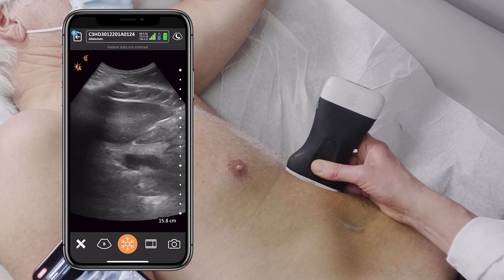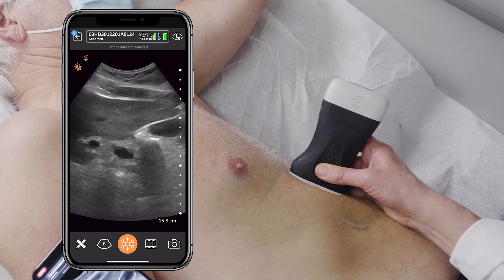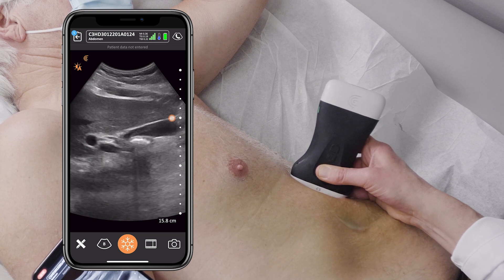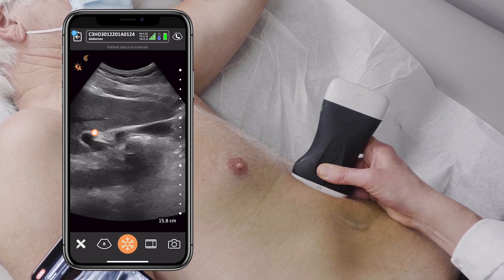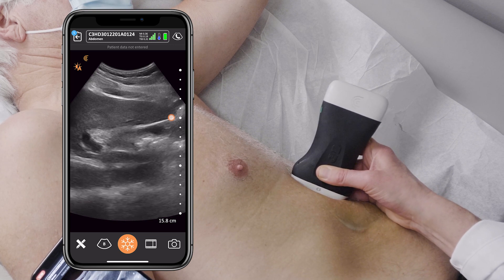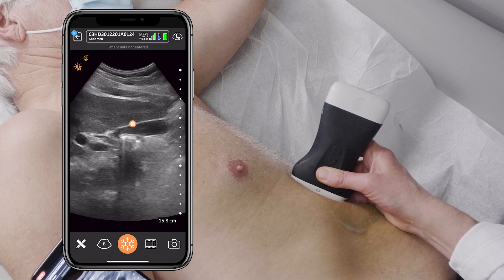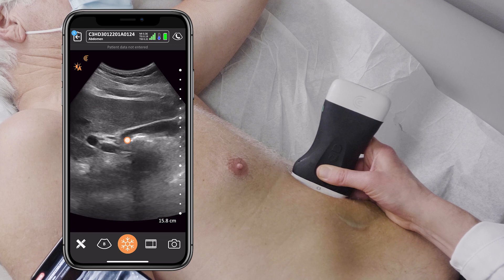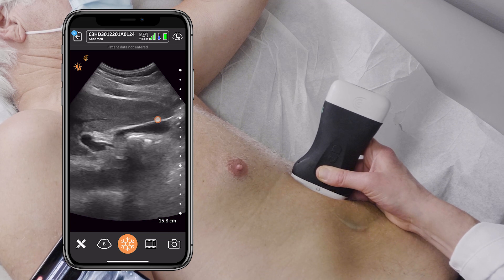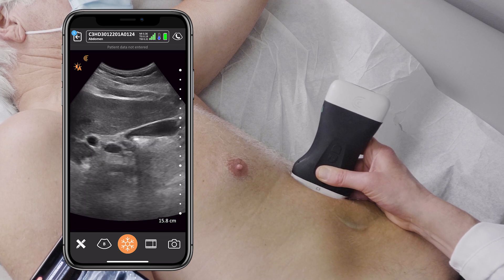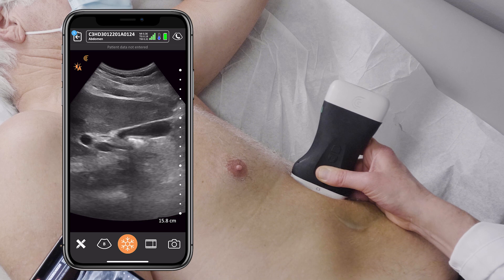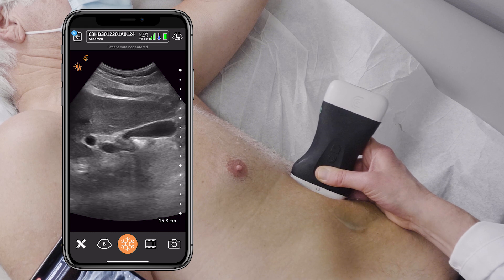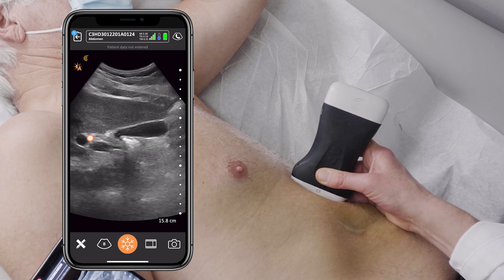I'm just going to follow the margin of the liver and you'll see that the gallbladder pops into view, looking like an exclamation mark — with the gallbladder being the upper part of the exclamation mark, and the portal vein being the dot.